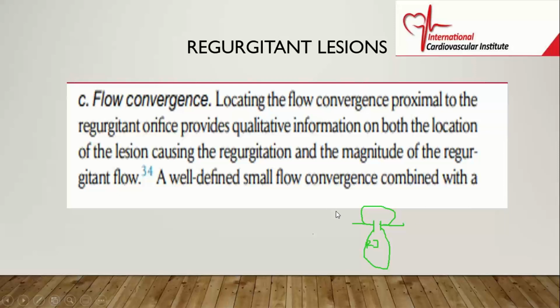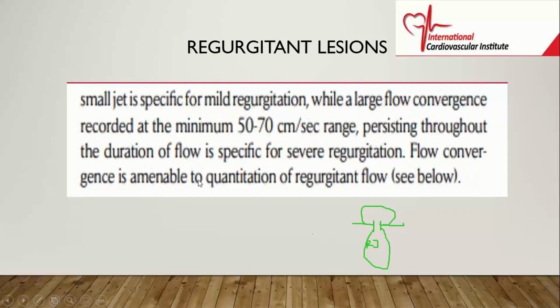So the three components that you need to know are the regurgitant flow, the vena contracta, and then the flow convergence. Those are the three components.